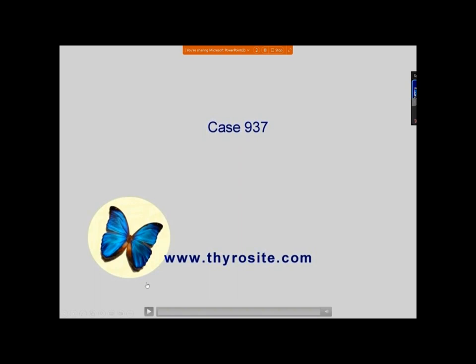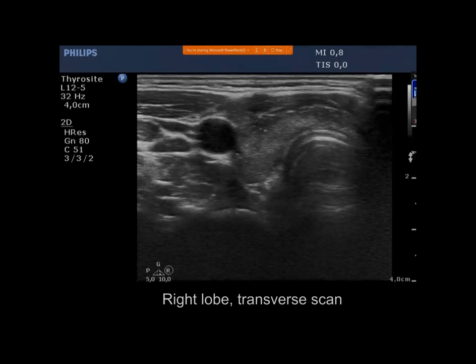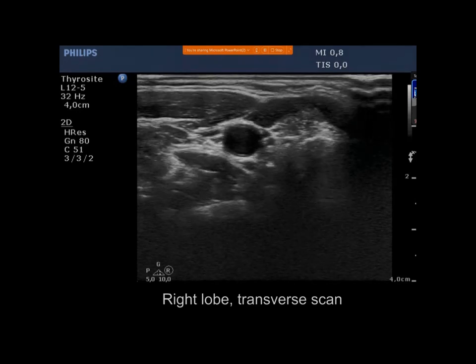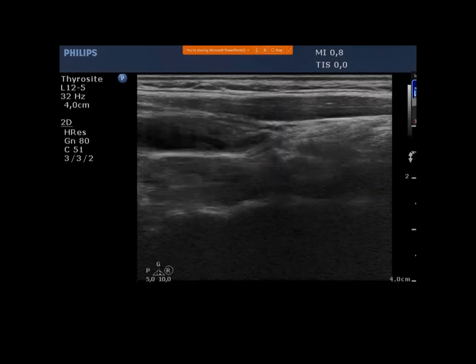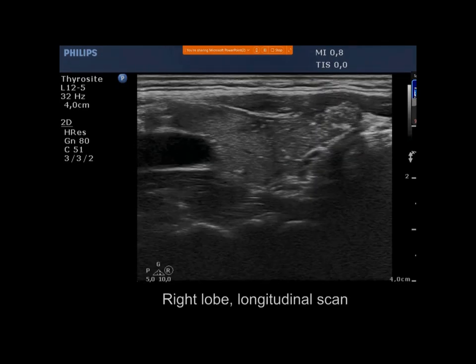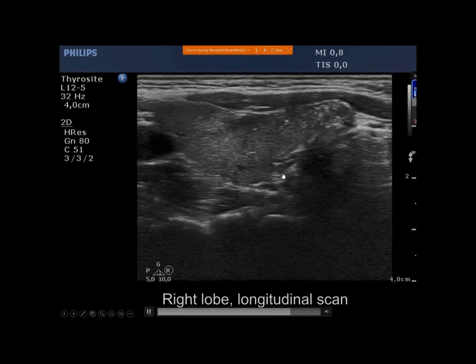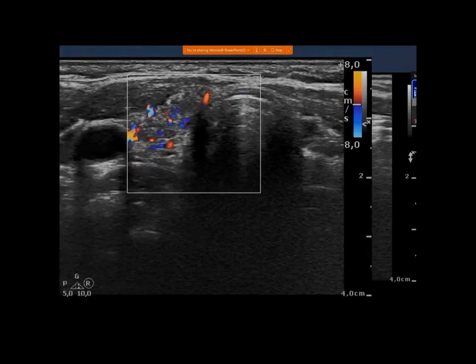Another example. Do you perform an FNA in this situation, or do you send the patient immediately to surgery? So back to the case. No, we have to perform FNA. I will present not such a convincing case, but not far from this case, which proved to be Hashimoto's thyroiditis. So we have to perform cytology from such nodules.